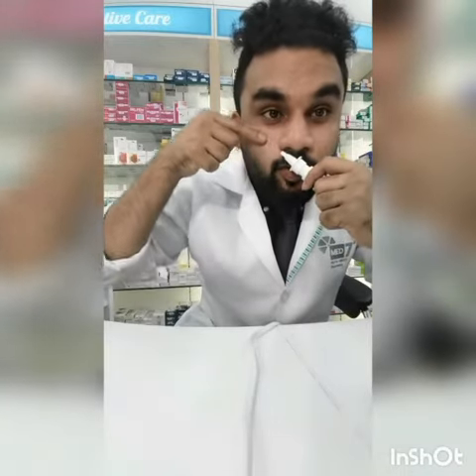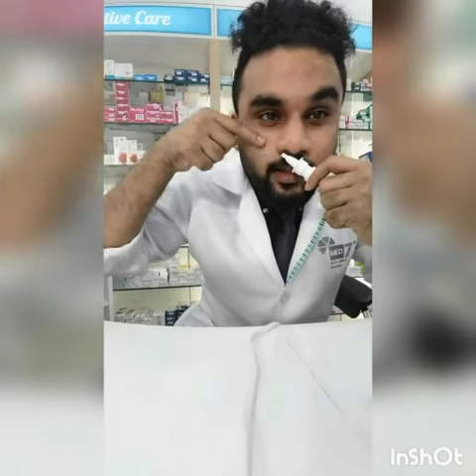I'm going to show how to use a nasal spray. Put it in the back, position it correctly, and then hold it in your right hand.